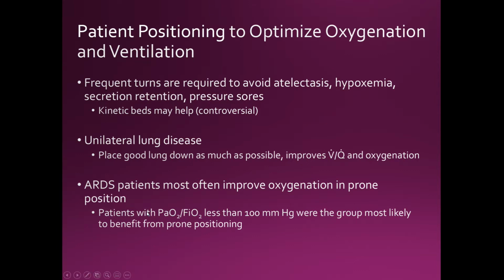You can still continue to give supplemental oxygen. You can put a nasal cannula on them just to increase that 85% to roughly around 90, 92. If you put the patient in a position that's going to improve oxygenation and they're kind of capped at a certain SpO2, why not put on a nasal cannula? Crank that sucker up.